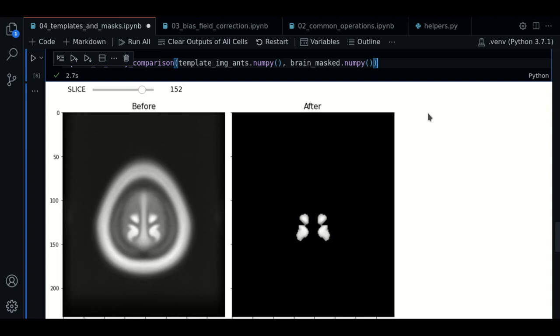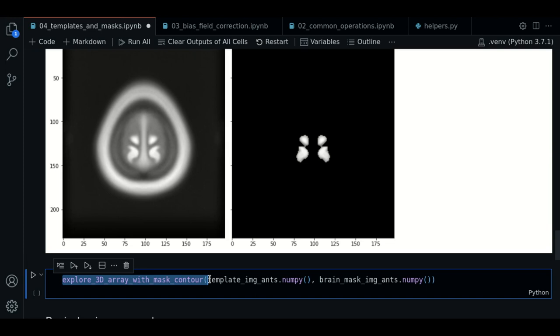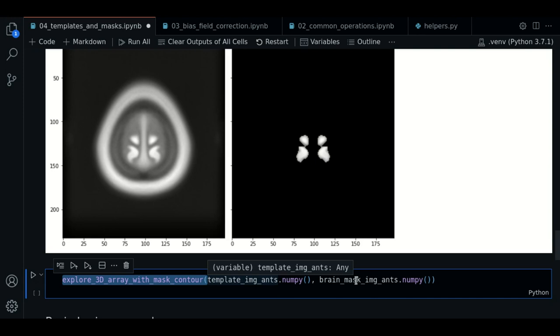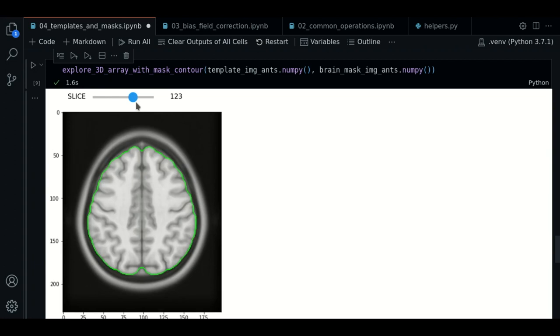So this plot works okay, but sometimes we want to see only the contours of the region delimited by the mask. For that purpose, we have this new function, explore3darray with mask contour, that is defined in the helpers model. It takes the numpy array of the image to mask and the mask. So we execute this and looks pretty good, right? So now we have the contours over the raw image.